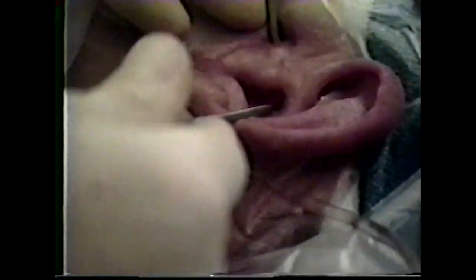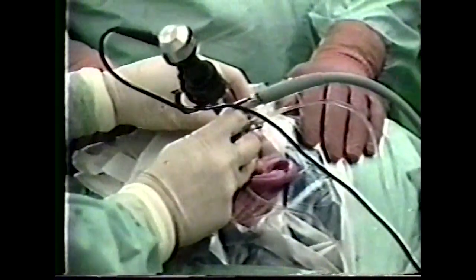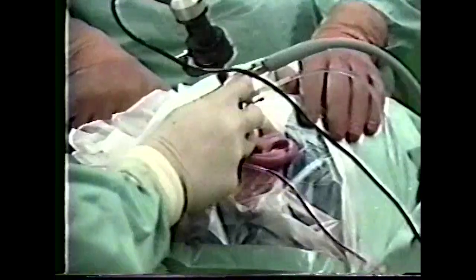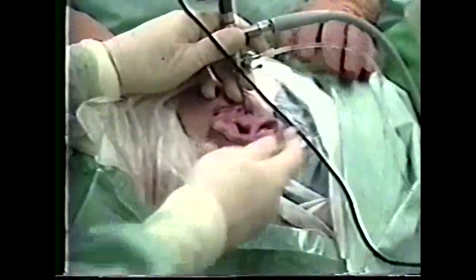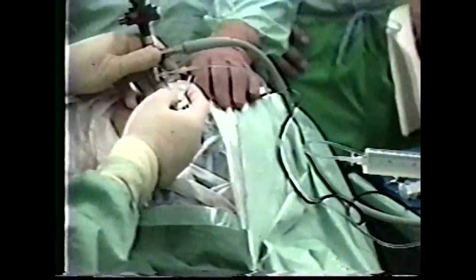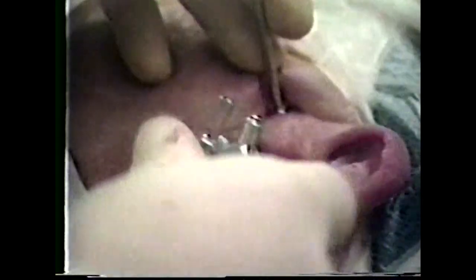To establish the Endaural portal, we first transilluminate the posterior wall of the joint as a guide to the position of the Endaural puncture. The anterior lateral outflow needle is removed at this point, and the joint distension is accomplished through the infralaterally positioned arthroscopic sheath. Guarding the tip with a finger, the 30-degree cannula and trocar are introduced into the joint space at the brightest portion of the transilluminated spot.